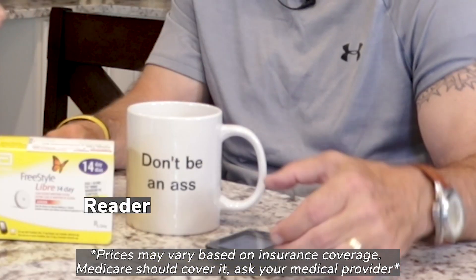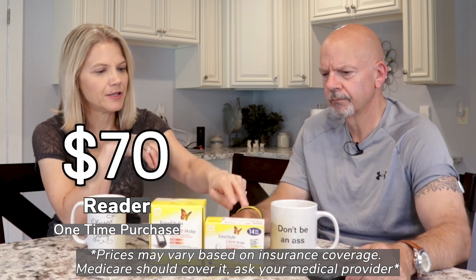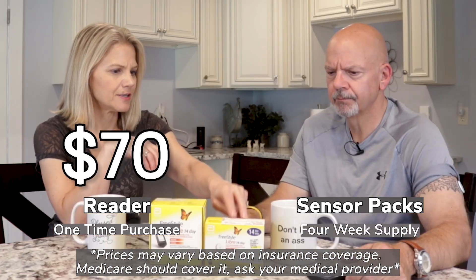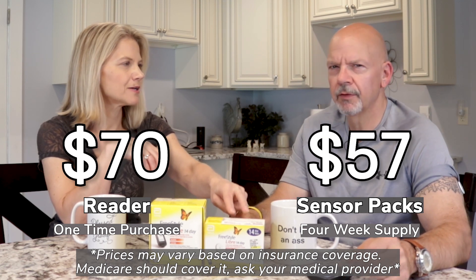In order to get it, you need a prescription. You have to buy two things: the reader, which is a one-time cost — with our insurance it was around $70 — and then you buy separate disposable 14-day sensor packs. Together, two of those — so a month's supply — was about $57.